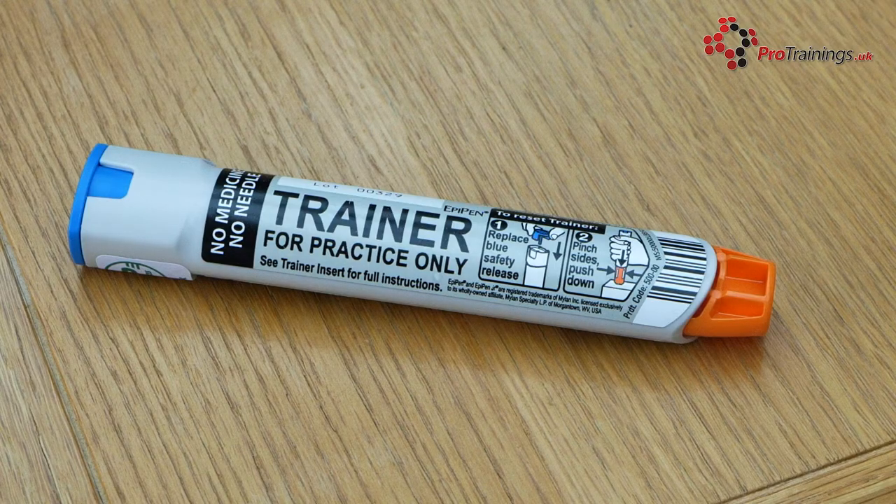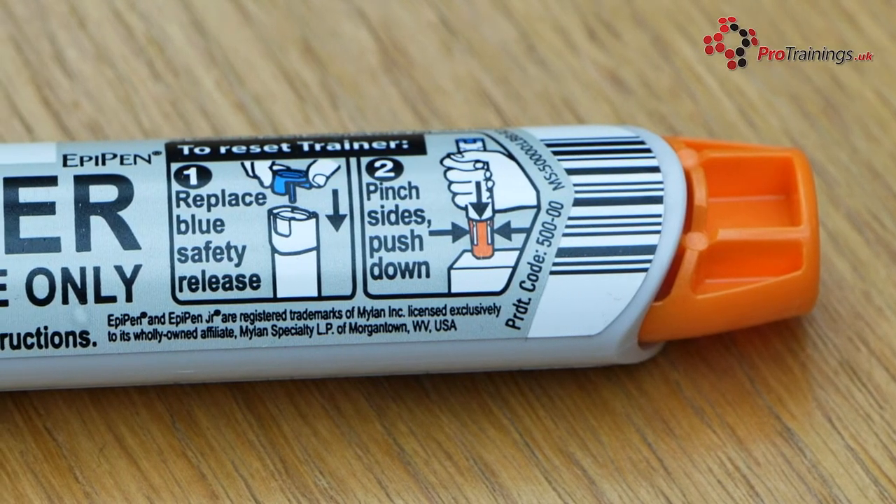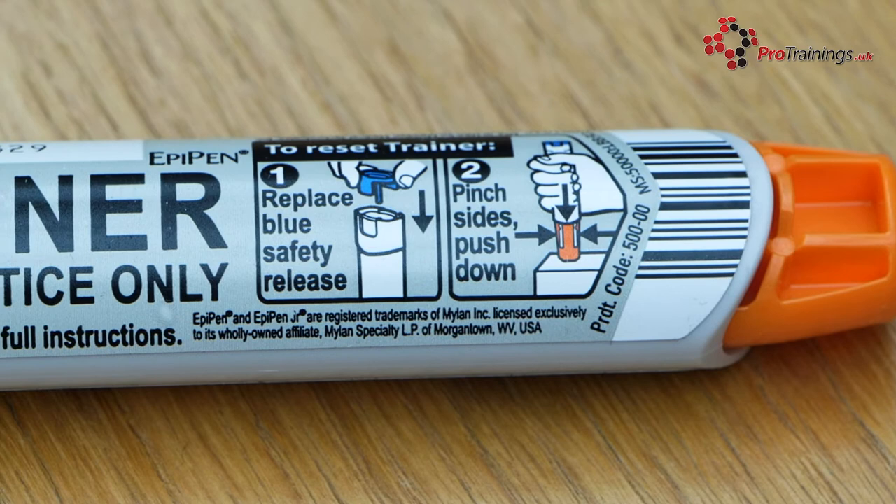The EpiPen is an auto-injector which administers adrenaline and is carried by people who have been diagnosed with anaphylaxis. As such, they can be used if the person goes into anaphylactic shock. Two types are available: the EpiPen and the EpiPen Junior.